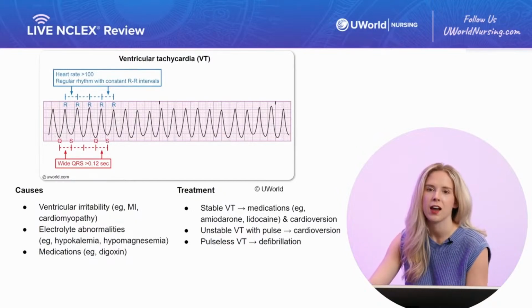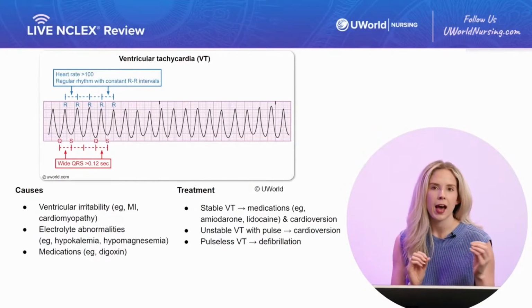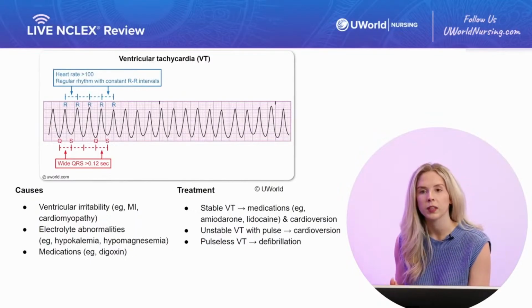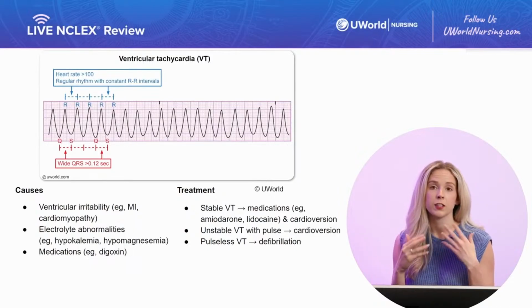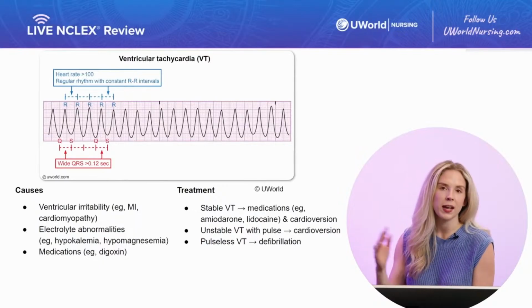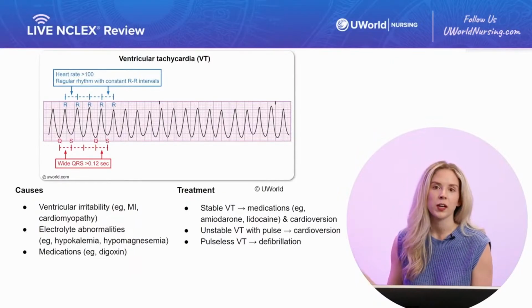I know this is tricky stuff, but that sync button is what I was looking for. So the answer is the sync button. The reason that we have the sync button engaged when we cardiovert as opposed to defibrillate is that the machine is going to find the rhythm of the R's and sync up so that we deliver the electricity at the right time to reset the heart. If this button is not engaged, it can fire at the wrong time and send the client into VFib, which we know can be fatal.